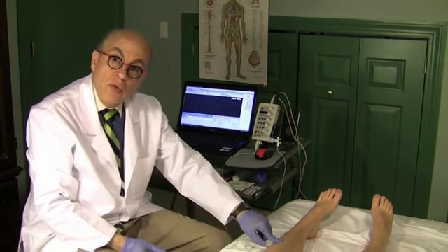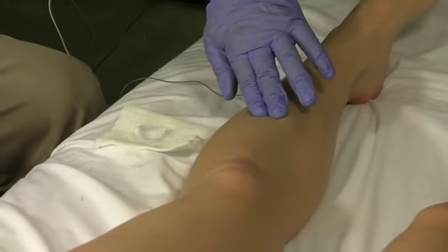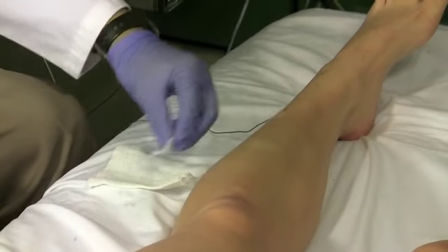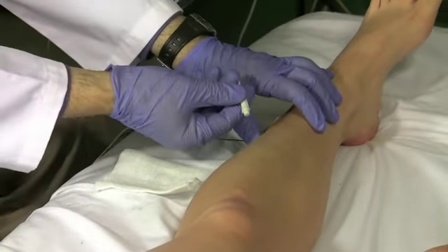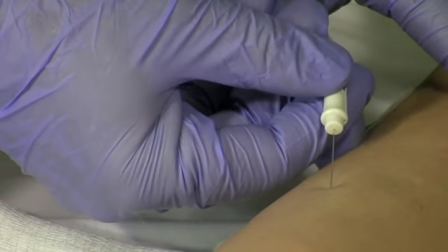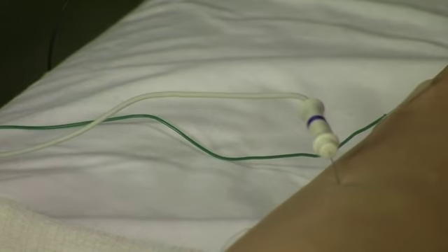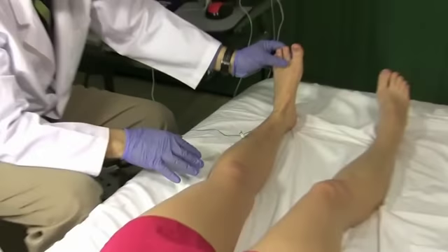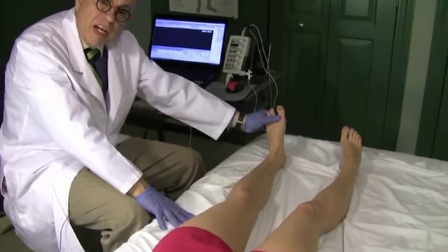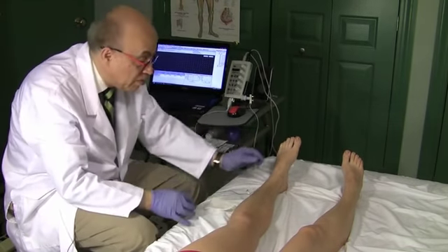The next muscle we do is the tibialis anterior, which is right here. This is the tibia. I do it about 2 finger breadths lateral to the tibia, right here. I'm going to stick it like so. Now notice I'm sticking the needle at about a 45-degree angle. The reason I do that is because when you move the muscle like so, the needle is going to become parallel to the muscle fibers, essentially. And so it hurts less than if you're putting it perpendicular.